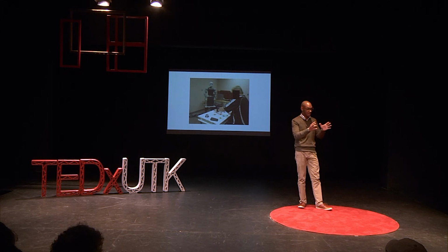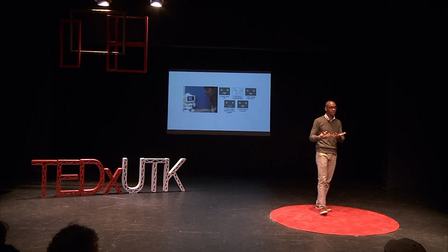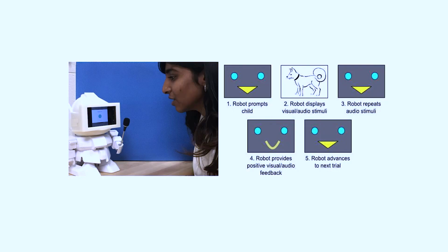So again, this picture is coming from a clinical setting, but this is a system that now has been piloted in the home setting, and we, in fact, are now using a variation on the same principle here at Tennessee, looking at the cochlear implant problem. Now again, as I mentioned, for children with cochlear implants, oftentimes they need lots of increased practice verbalizing, hearing how a word is verbalized, and associating that with an image.